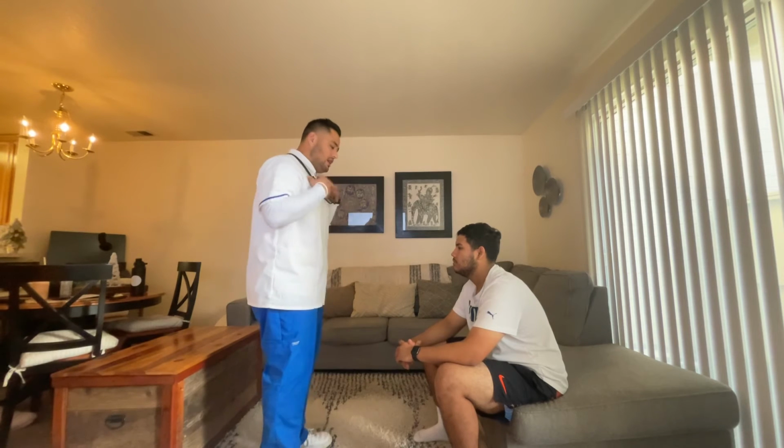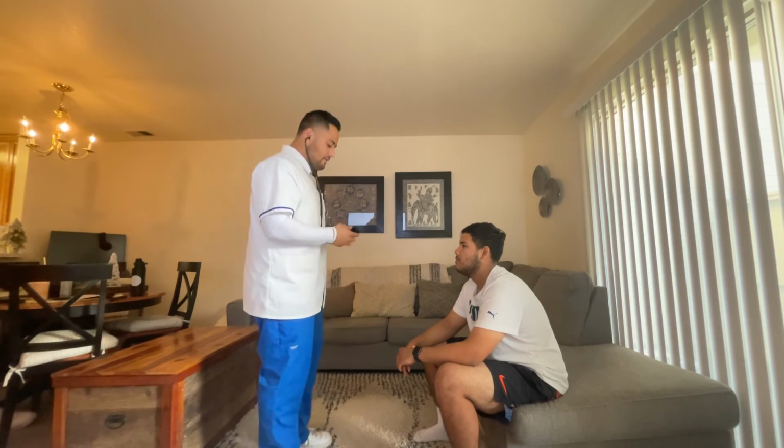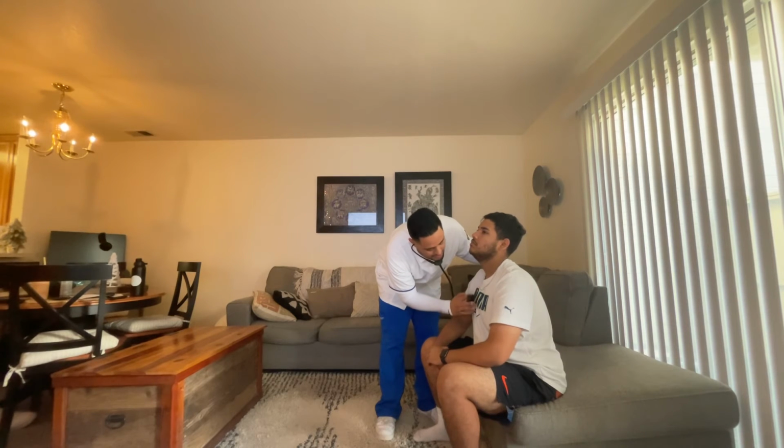I am going to be auscultating your heart sounds. Is that okay with you? Perfect. I'm going to be auscultating his heart sounds, beginning with the aortic valve with the diaphragm of my stethoscope. And the aortic is going to be at the right second intercostal space of the sternal border. Heart sounds are heard. S2 is heard slightly louder.